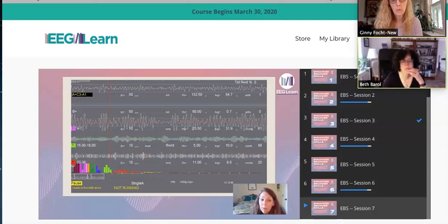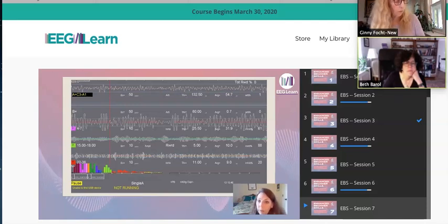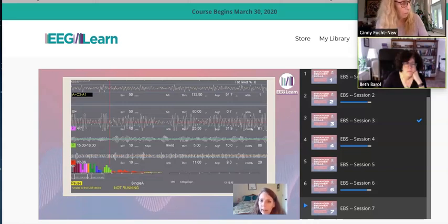And then since I've made these first two thresholds pretty easy, now I can really concentrate on making that slow wave threshold tough. So if the average amplitude was coming in at 31.9 microvolts, then I want to set the threshold at least a little bit lower than the average amplitude is already coming in. So I have it at 25.5.